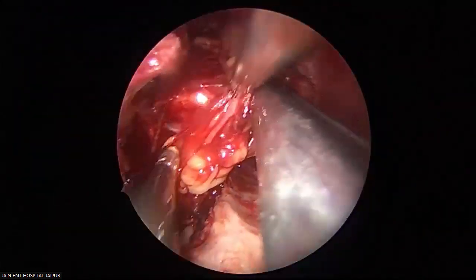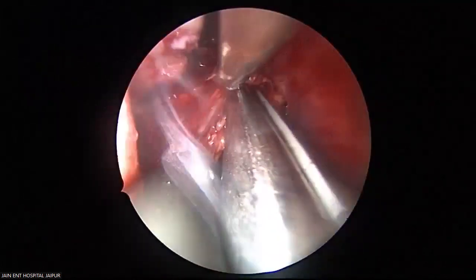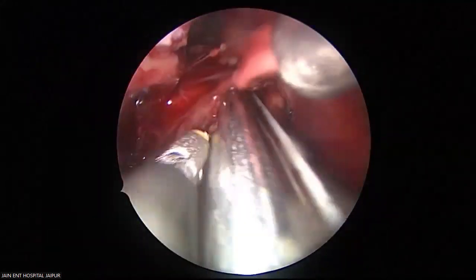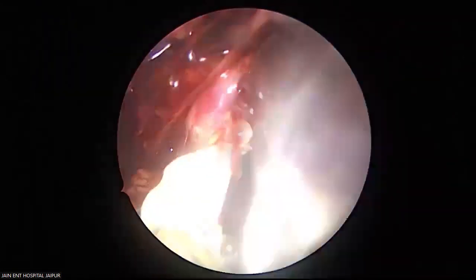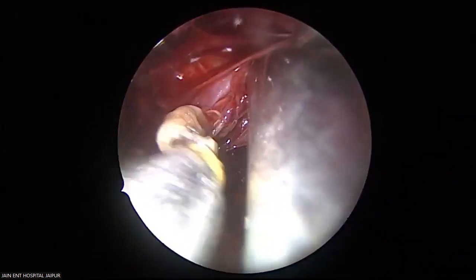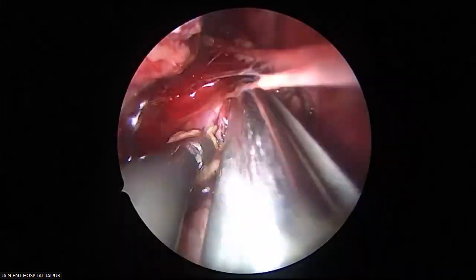Pull it more and more. And with coblation, surface bleeding will stop. Cleaning the surface. See that? There are surface vessels.